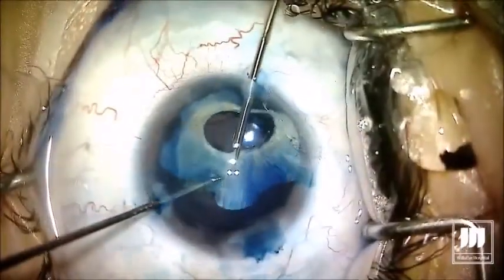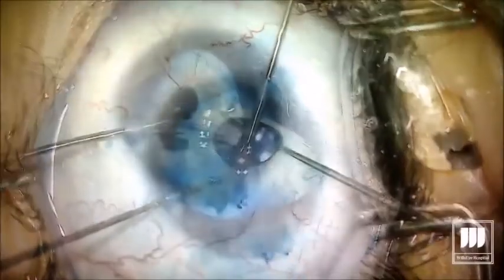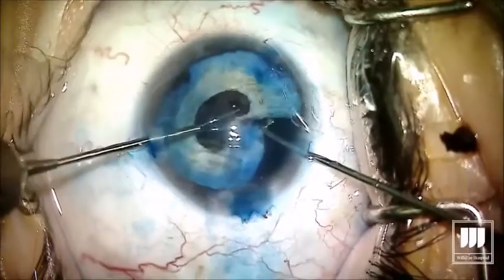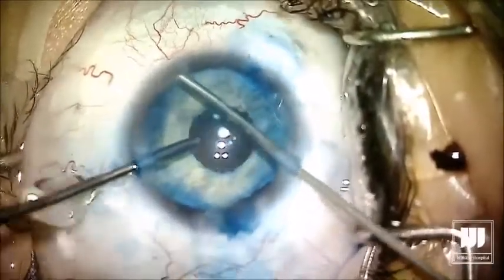The iris prosthesis will go in — it does not like to go into the capsular bag. There are some people who say these actually work better when placed in the sulcus, but I do think that in-the-bag fixation is very nice: the eyes are very quiet and it holds the iris prosthesis in place quite well. But it does take a little tugging and pushing and pulling, as you can see in the video.